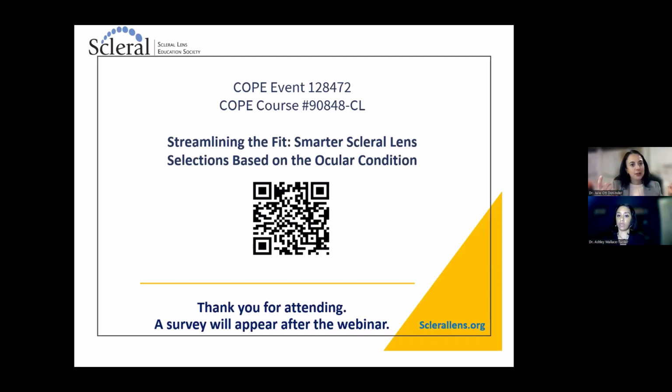Think about when you're doing your phoropter or your refraction, or thinking about how much a toric lens is rotated, and think of a clock hour as 30 degrees. Just look and see where the markings are. Let's say the markings are off this way, and it looks like it's about 7 o'clock. Well, then I would probably put in my chart 30 degrees rotation, temporal, nasal, clockwise, counterclockwise, however I note it myself, or note that the marks were at 7 o'clock if I can't measure specifically to the degree.